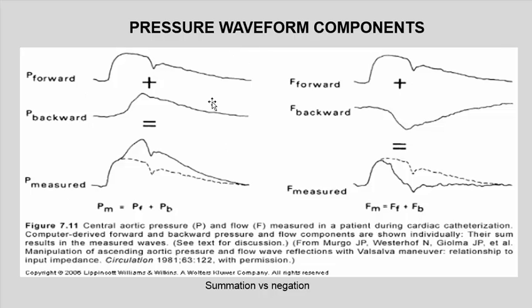Pressure is shown on the left side here, again pressure against time, but on the right side we have flow against time. And consider the pressure doesn't really have direction, or more correctly, it has omnidirections. It's omnidirectional. Whereas flow, a river can flow forward or back. It's driven by gravity, of course, but flow is directional.